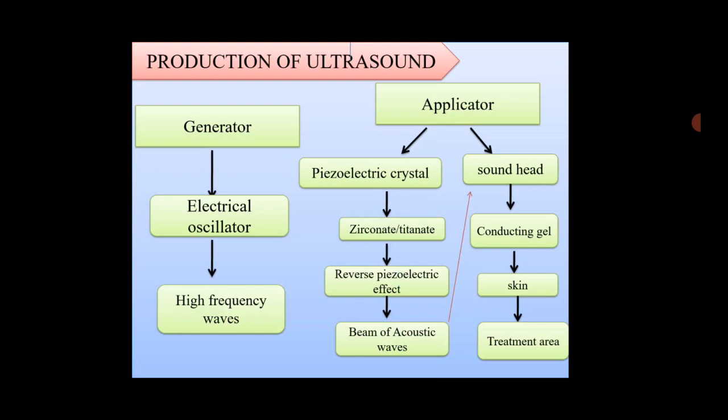Piezoelectric crystal will be made up of zirconate or titanate, which has piezoelectric properties, that is expanding and compression. When the electric current changes its polarity, this expanding and contracting will occur alternatively. So that will result in the reverse piezoelectric effect. Because of that, a beam of acoustic waves will be produced, which will pass through the sound head and reach the conducting gel and finally reach the treatment area.